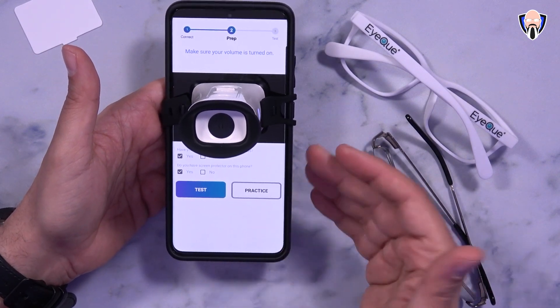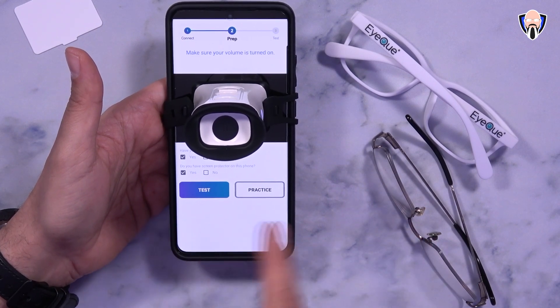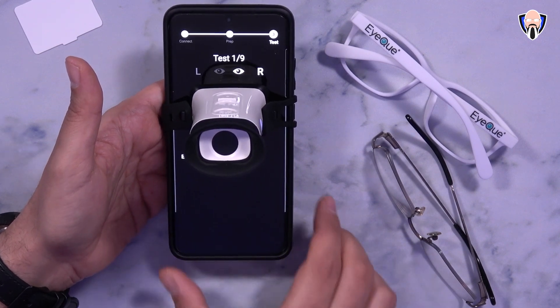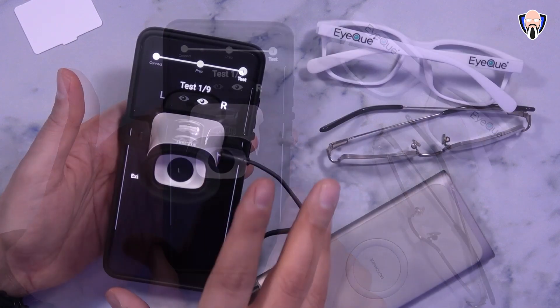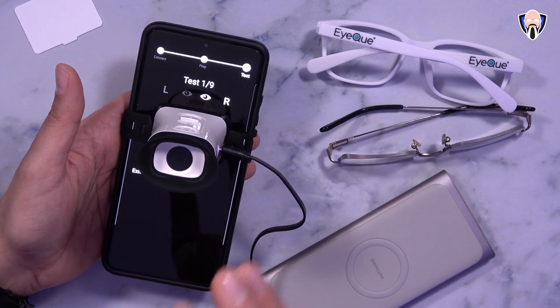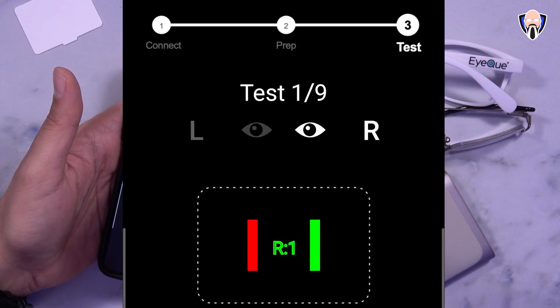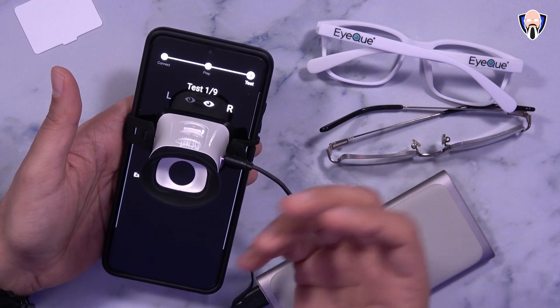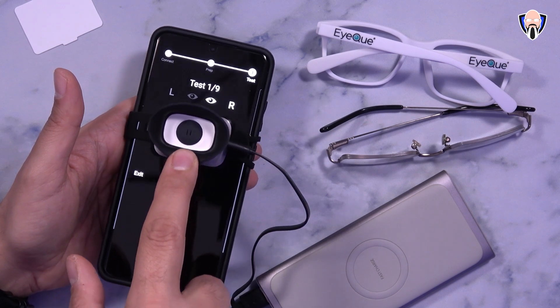This is the process where you'll go in and take a practice or take an actual test. Practice and the test are pretty much the same — the only difference is practice doesn't register the information. Let's go ahead and go to the test. Let's start with your first measurement — hold the device at reading distance. The instructions here are very clear. What it's asking us to do is not close any one of our eyes. We're going to be testing the right eye first — it's highlighting the right eye. Hold the phone within reading distance, basically the distance that you read a book, a magazine, or anything like that — put it at that level and then look at the two inserts. You'll notice there's some color light — there's a green and a red light.